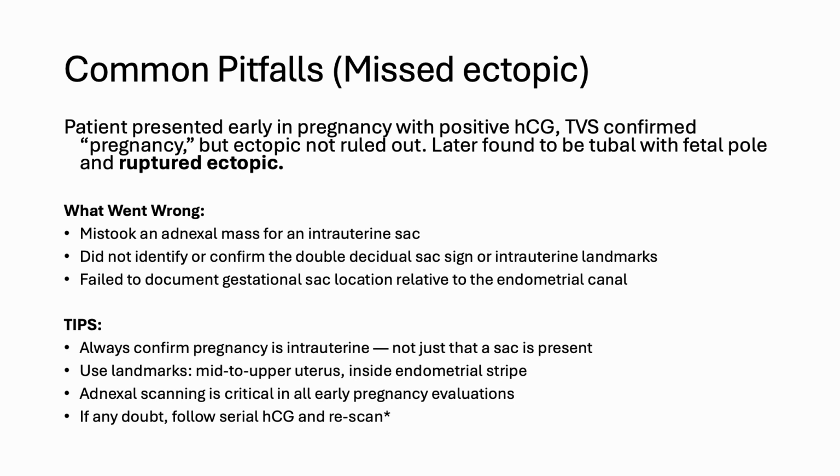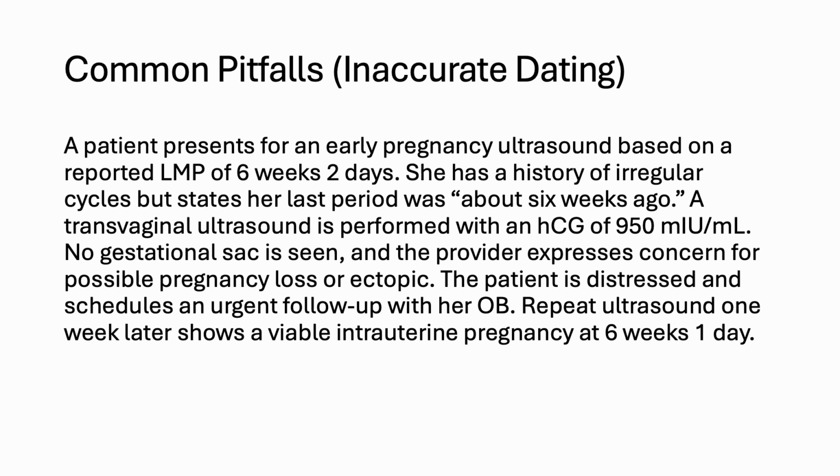Get someone else to come in and look with you if you're ever concerned about an ectopic or you're just not confident in your sono. So inaccurate dating, another common pitfall.